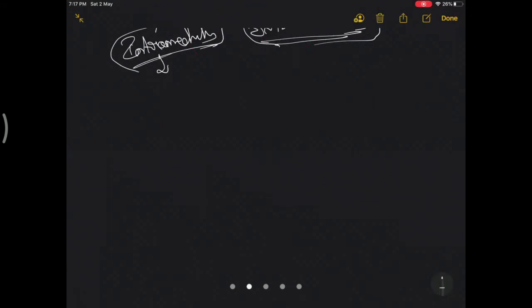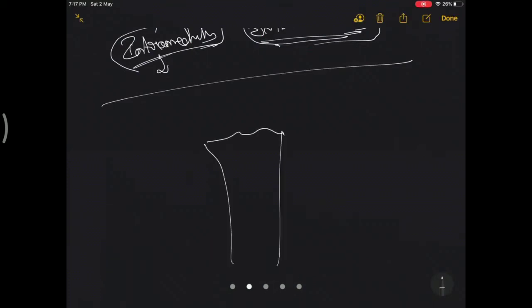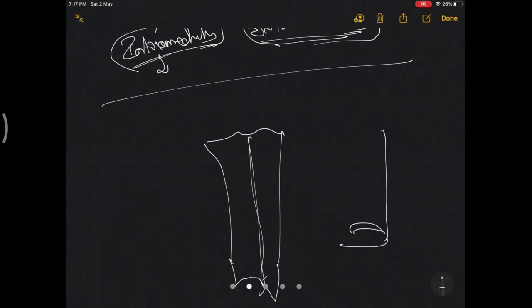So let's study as it is seen. This is the tibia, and this is the ankle, and this is the shin. You have an extramedullary jig with two clips like this, which anchors at the ankle, and you have a semicircular jig here, with three planes of change.